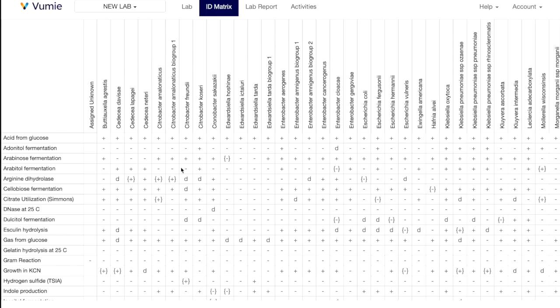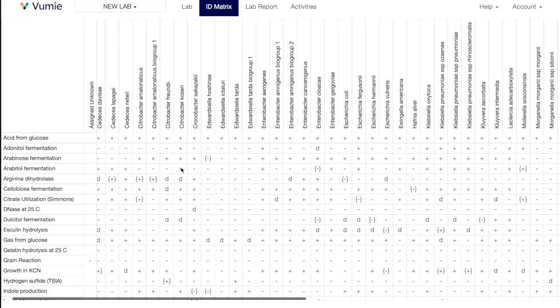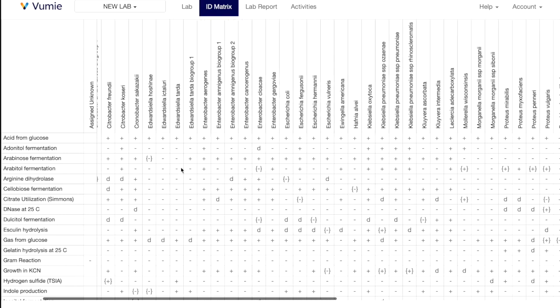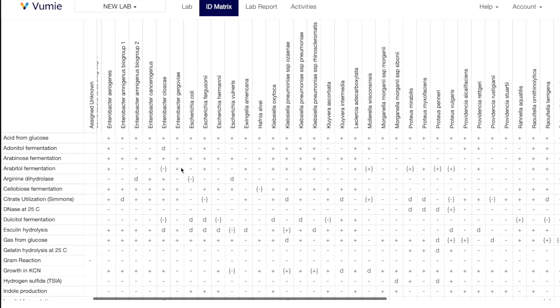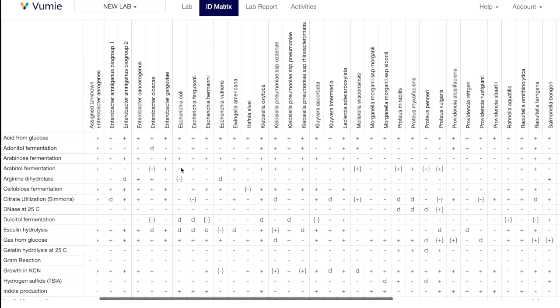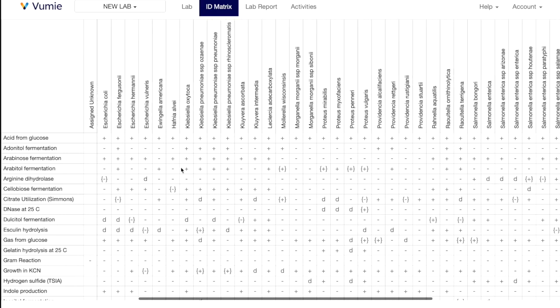ID matrices are the result of a tremendous amount of work with typically thousands of isolated bacteria being studied to see what their metabolic capabilities look like.